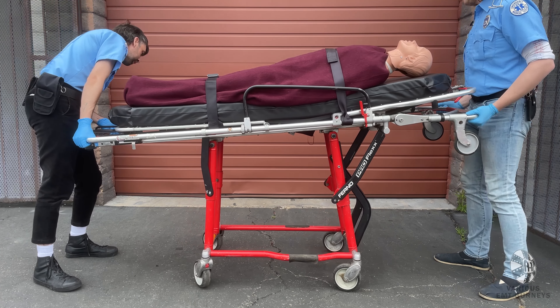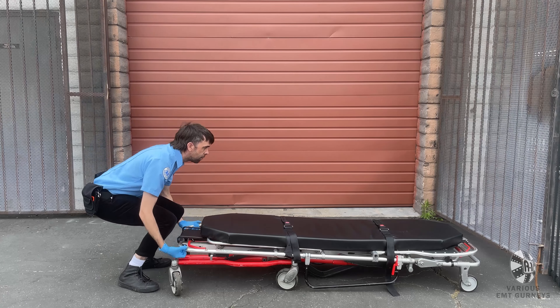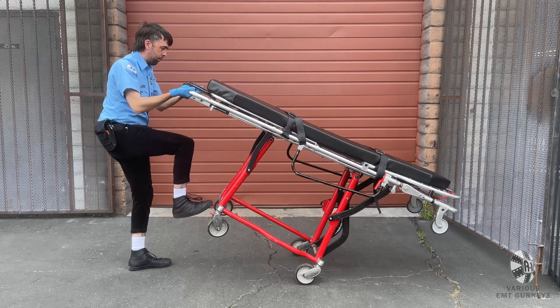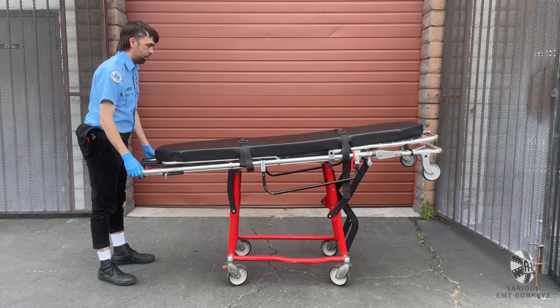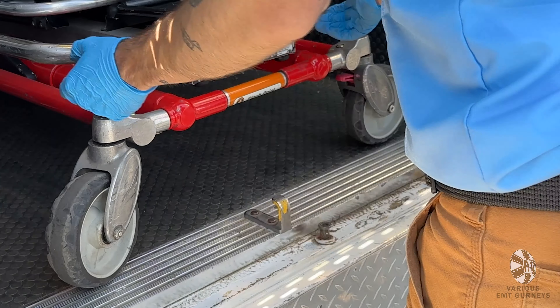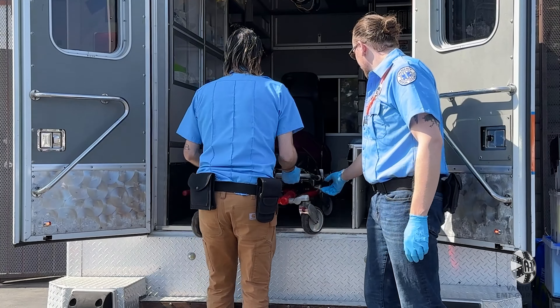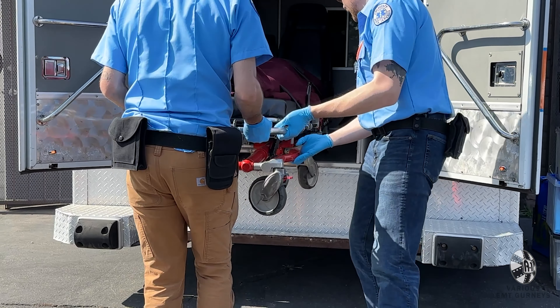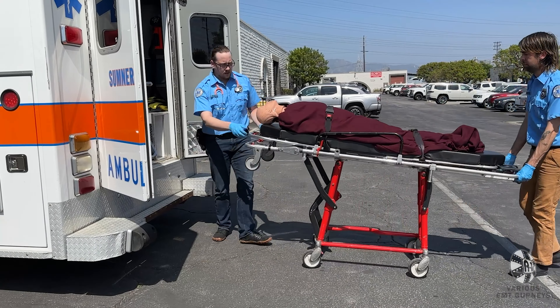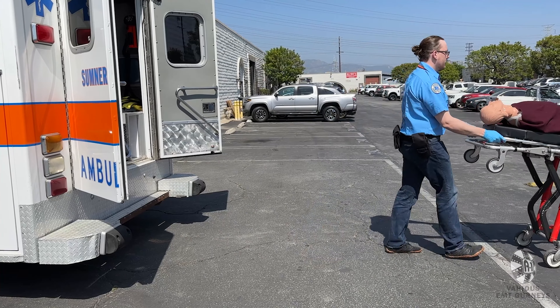You can also raise the gurney by yourself by tilting the foot end up until the undercarriage locks into place. If your gurney has been loaded into an ambulance, to take it out, you will switch to the loading position. Grab the frame and start to pull, then have a second operator lower the undercarriage to the ground. Make sure that the undercarriage locks into place before pulling the gurney out completely.